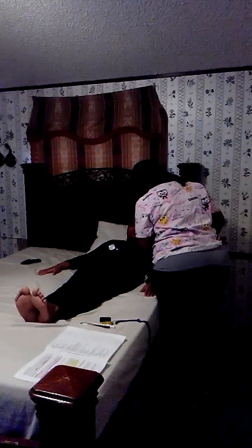I have a stethoscope and a cuff. Okay, Miss Sheikah. It's gonna be a little tight on your arm, okay? Mm-hmm. Miss Sheikah's blood pressure was normal, 122 over 80.